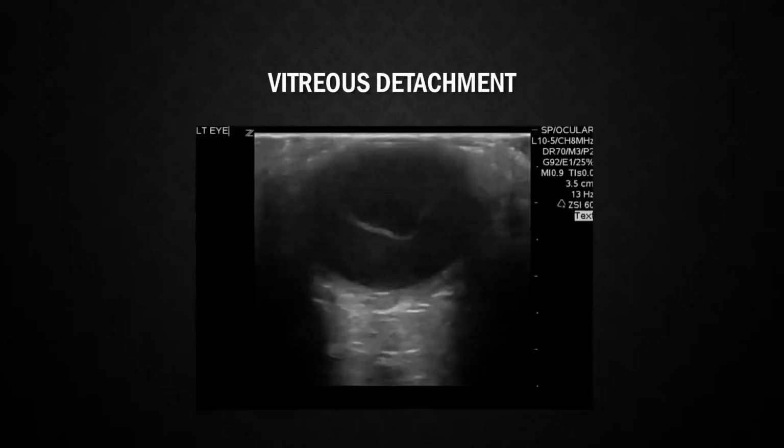So this here is a vitreous detachment. Again, as you get older, you are at risk for this. So the vitreous is not tethered to the optic disc, so it's going to be more free floating and more mobile. It tends to be a thinner membrane than the retinal detachments that we saw on the last page. And when you move the eye, it'll probably move around a lot more than you saw on the prior video.